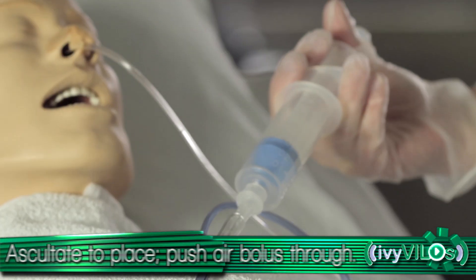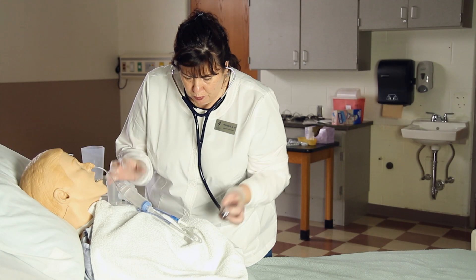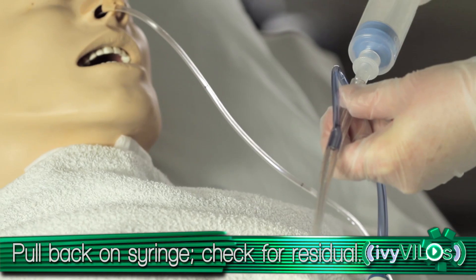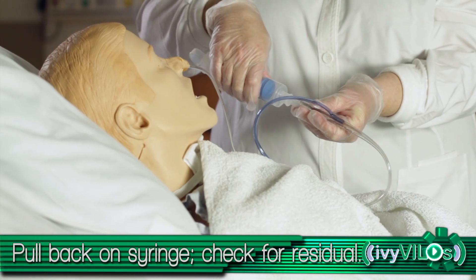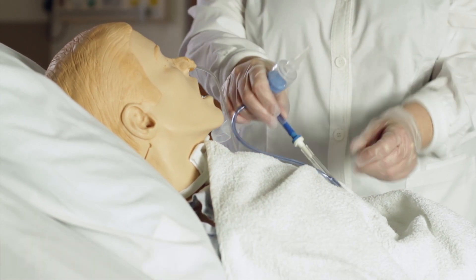Push the air bolus all the way through. Pull back on the syringe to check for residual tube feeding in the stomach. Once placement is verified, detach syringe and replug tubing.